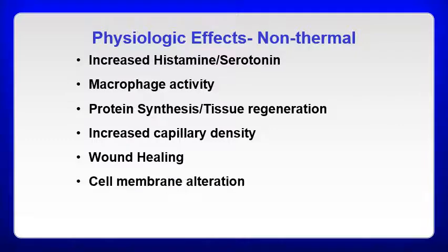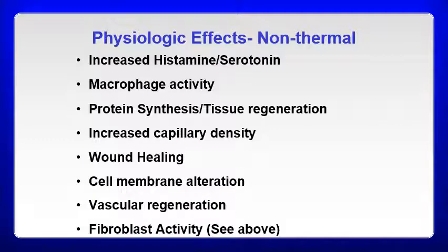Improved wound healing, cell membrane alteration, vascular regeneration, and the fibroblast activity, which we just talked about. So again, histamine, if you think about all the connections between all of these things in the inflammatory process to the repair process, the belief is that the mechanical effects of pulsed ultrasound could enhance these processes as they're happening in the body, and help expedite what's actually occurring through that process.